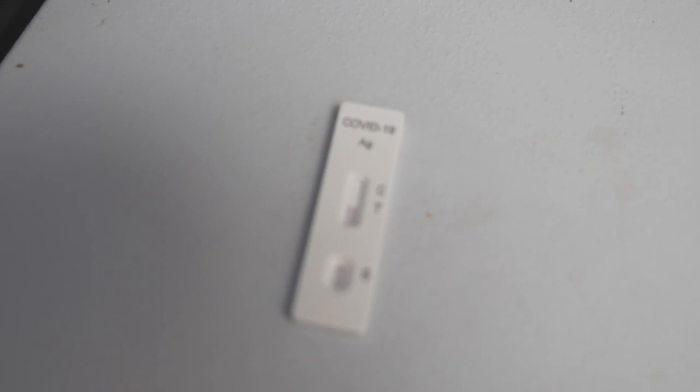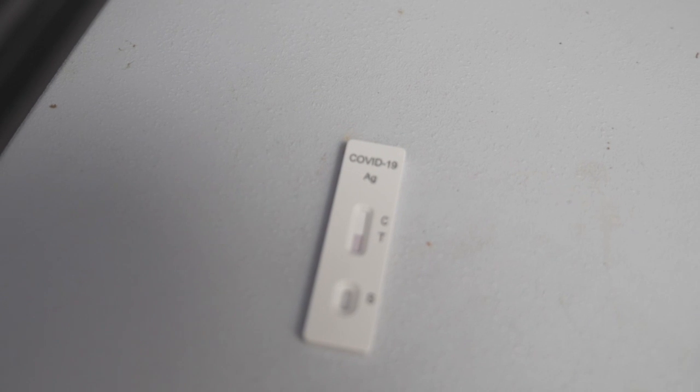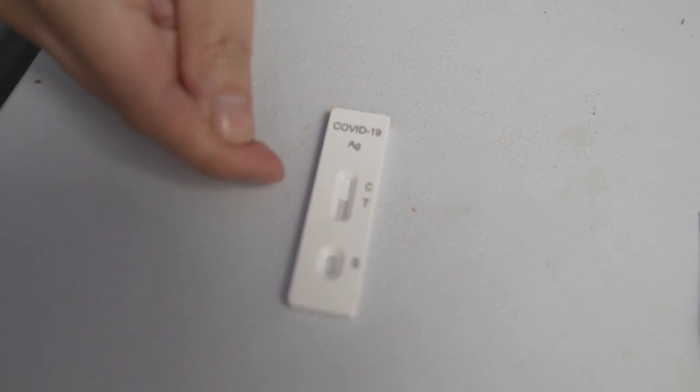Oh, look at this, it's going up, and soon it's going to tell me if I have COVID. But actually that soon is 10 minutes, so I'll probably end up cutting the video and coming back to it. But if you look at it, it's going up.